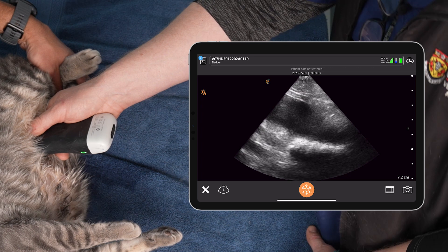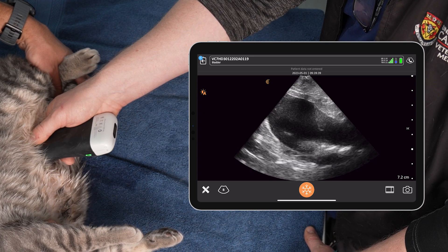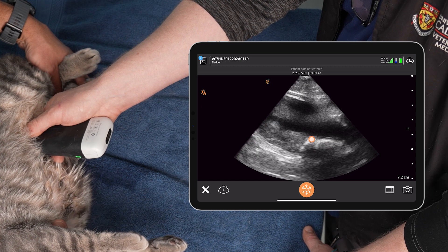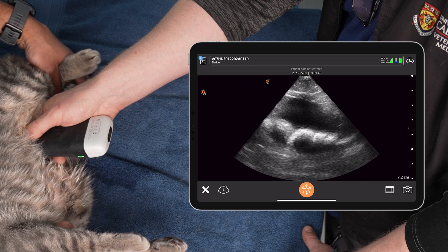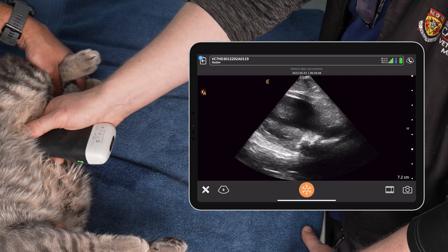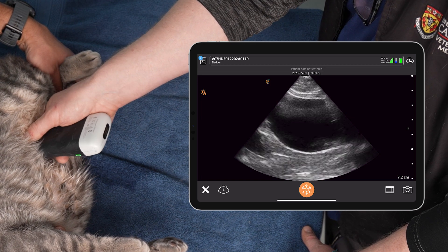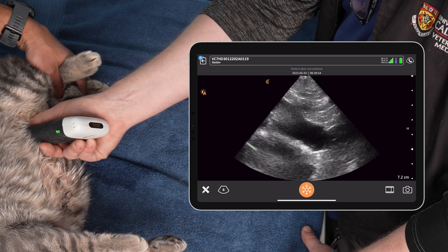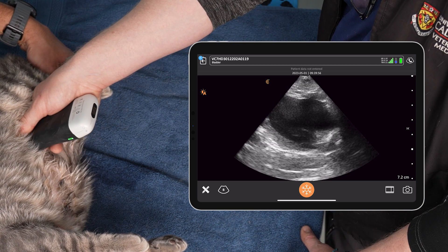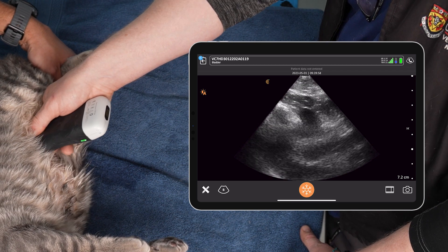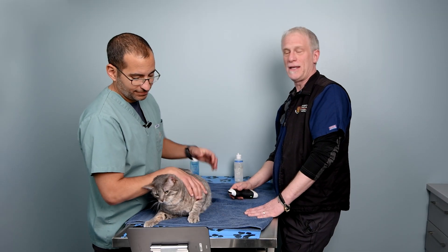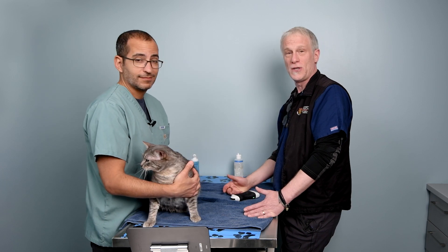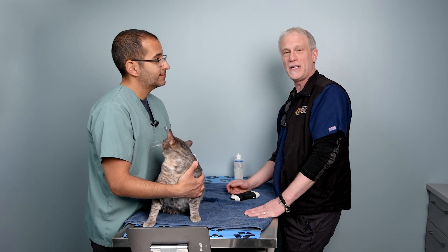One thing to be careful about: the colon can sometimes mimic bladder stones, especially if you're not fanning — you can see that right here. What you want to do is fan the probe to see the colon elongate and disappear. The colon is gas- and fluid-filled, so it will elongate and disappear when you fan, but if kept stationary it mimics a bladder stone. That is our urinary bladder site — we'll move on to our next site, the kidneys. Thank you for joining us until next time.